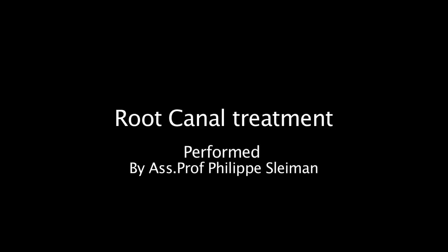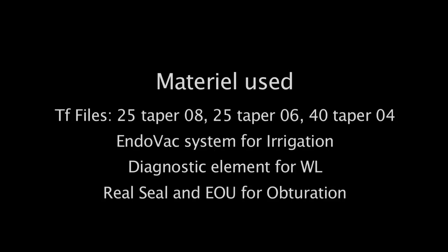Welcome to the root canal treatment video. The materials used in this movie are TF25-08 and 25-06 for the crown down, 40-04 for apical enlargement, EndoVac system for irrigation, diagnostic element for working lengths, and RealSeal and element obturation unit for obturation.